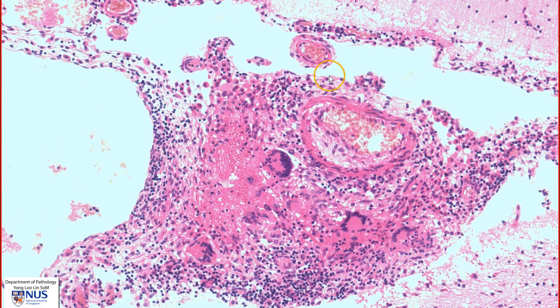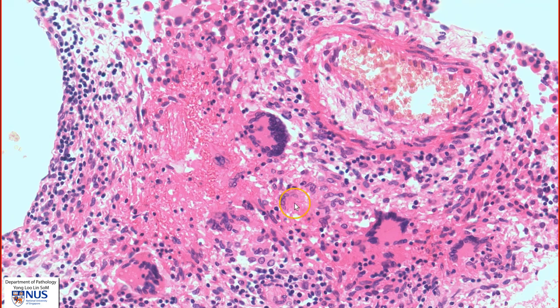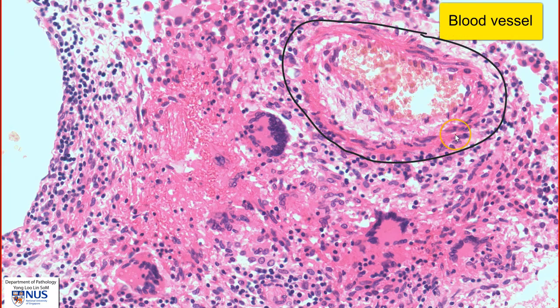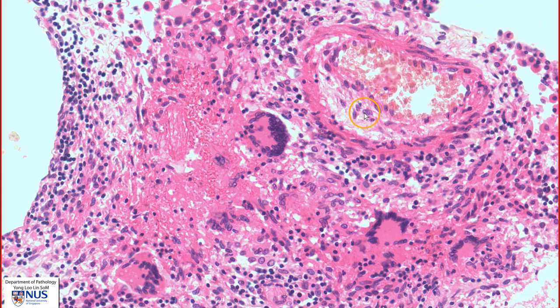Here is another such area where we can see necrosis, granulomas comprising these epithelioid histiocytes, and Langhans-type giant cells. We also have a blood vessel here that is damaged with some proliferation in the subintimal tissue.